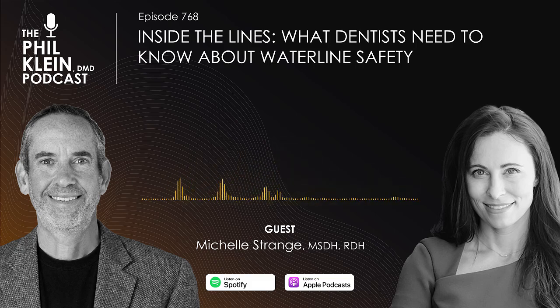Either way, you're separating yourself from the municipal water system, and you're controlling what that water is as far as being decontaminated by how you treat it. But both systems have to be tested, shocked, and maintained. And we're going to be talking about that. So let's hit the first question.